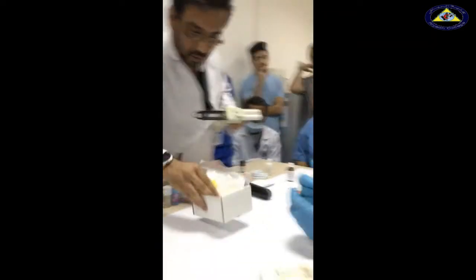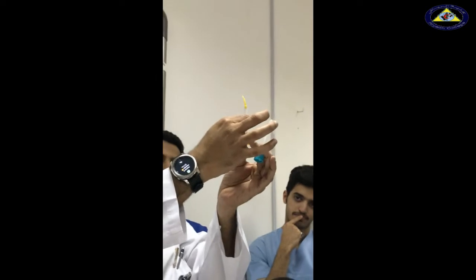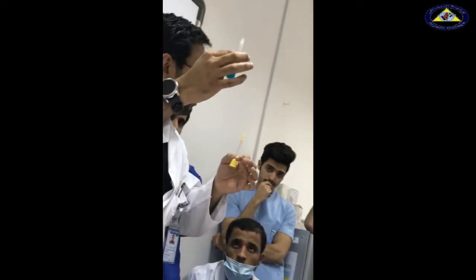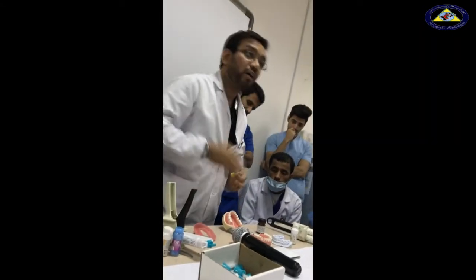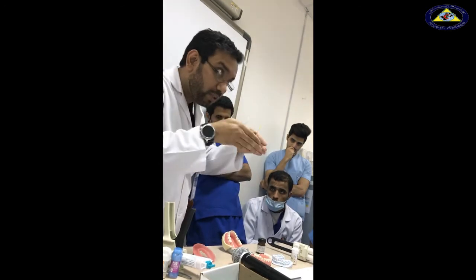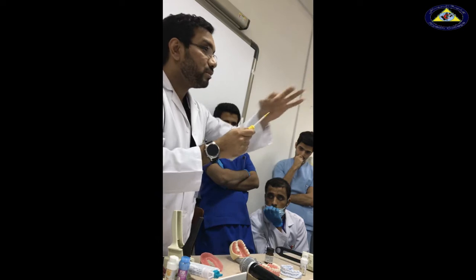What are the dispensing tips? You have different types of tips with two different thickness bores. A thicker one and a thinner one. The thicker one goes on the heavy body, because you have to dispense more material in the same amount of time. This one comes with a finer nozzle so that you can concentrate the material at the finish line and inject into the gingival sulcus, since you have just retracted the tissue.